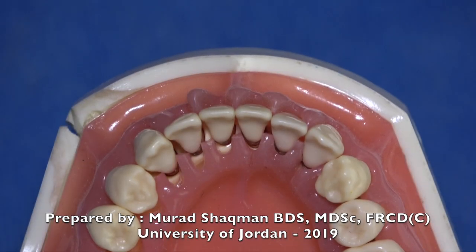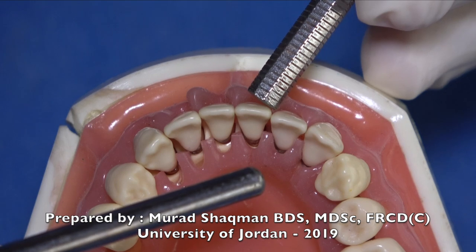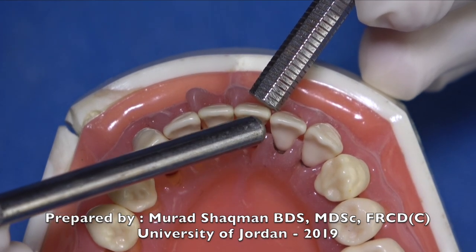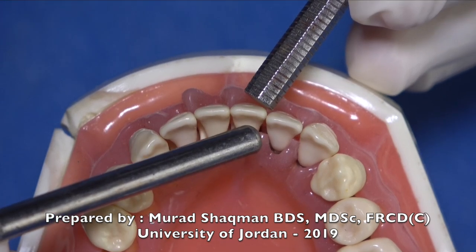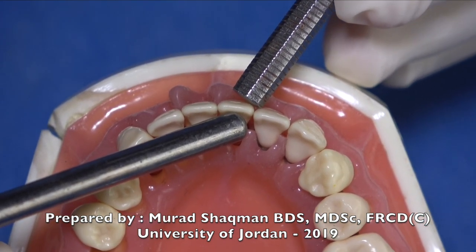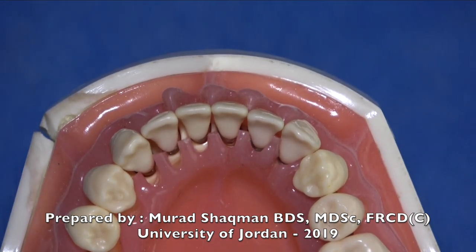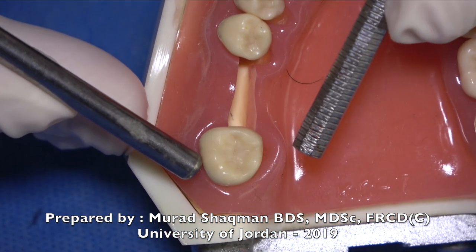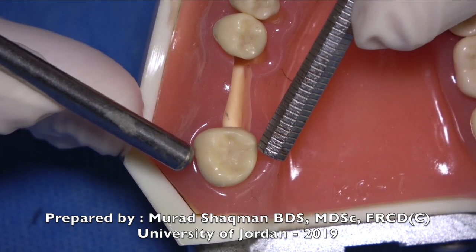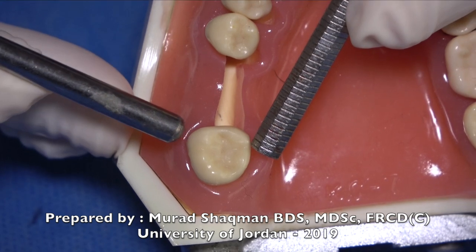For examination of mobility, apply one instrument and push with the other. What students often do incorrectly is trap the tooth between two instrument handles and shake — which really shakes the patient's head. The preferred method is to apply and hold one handle and then push with the other.